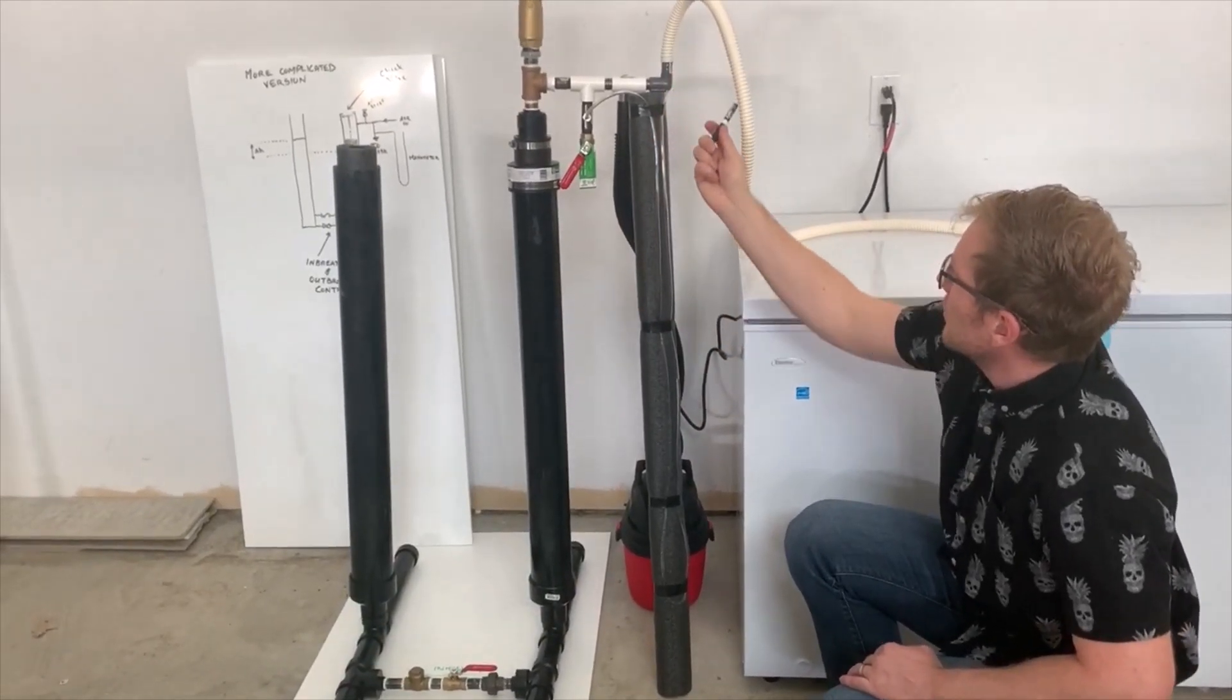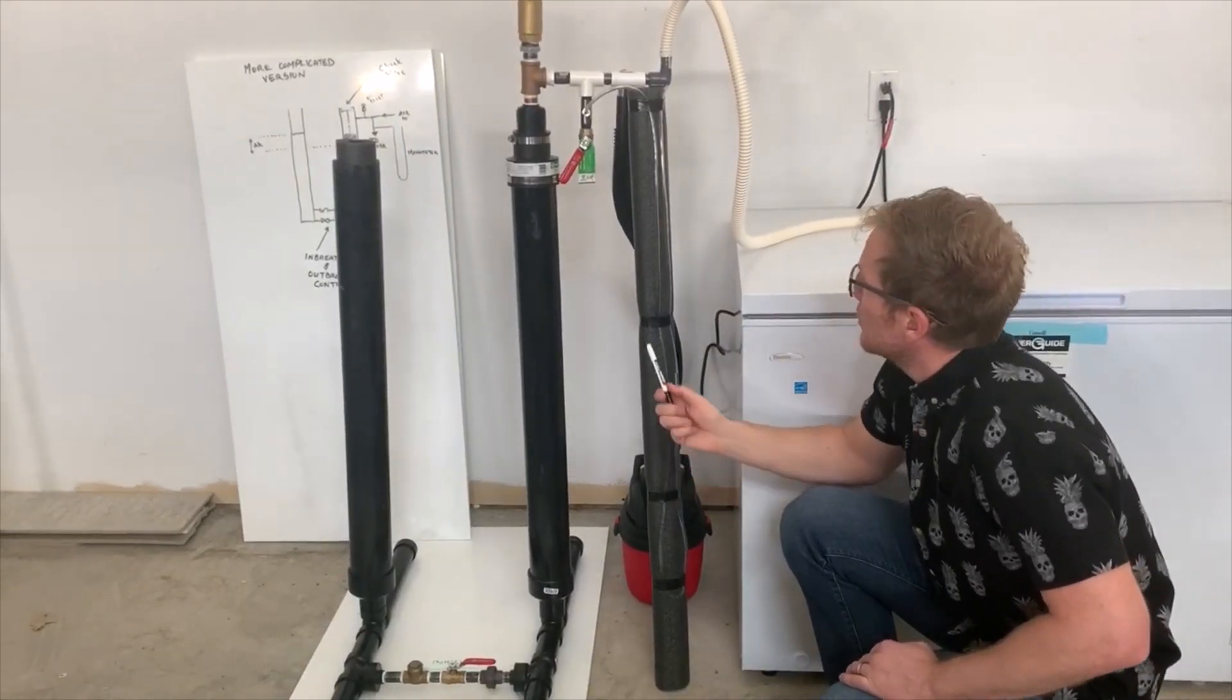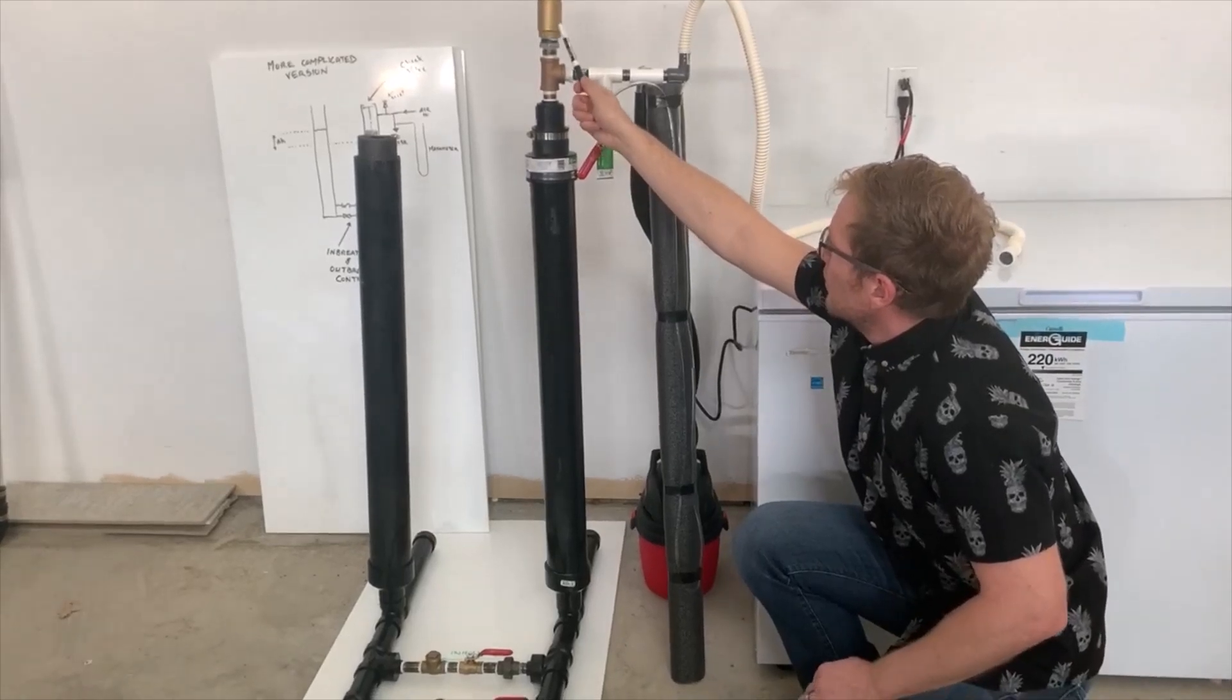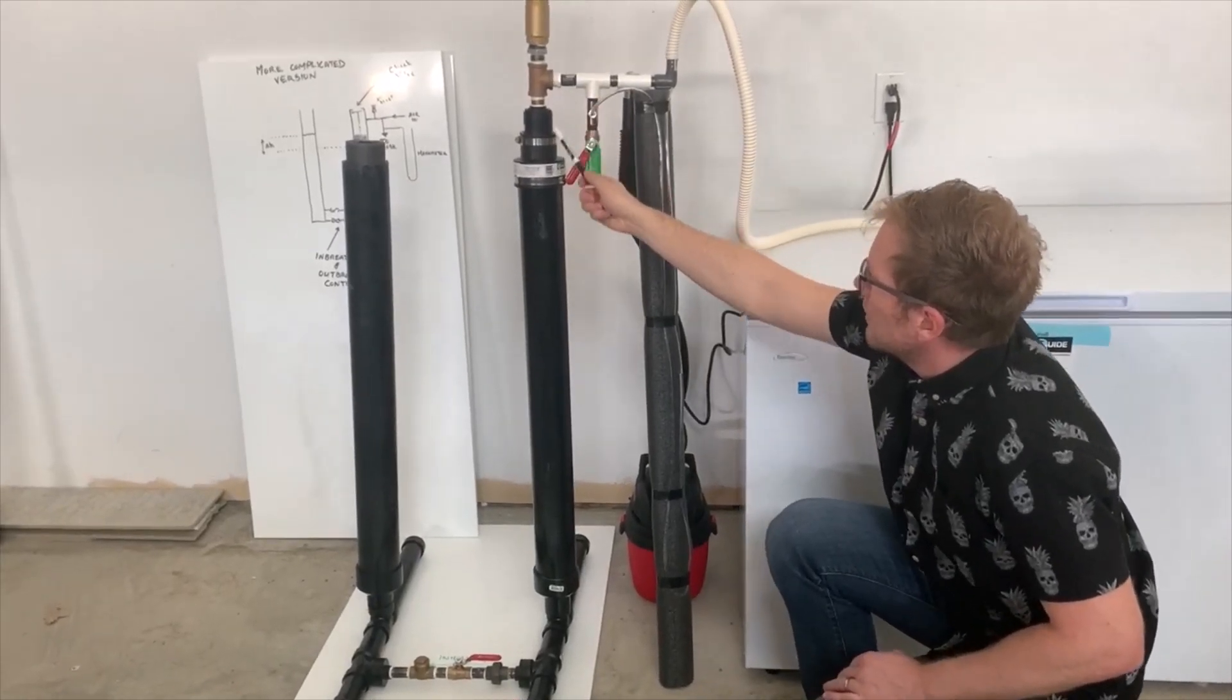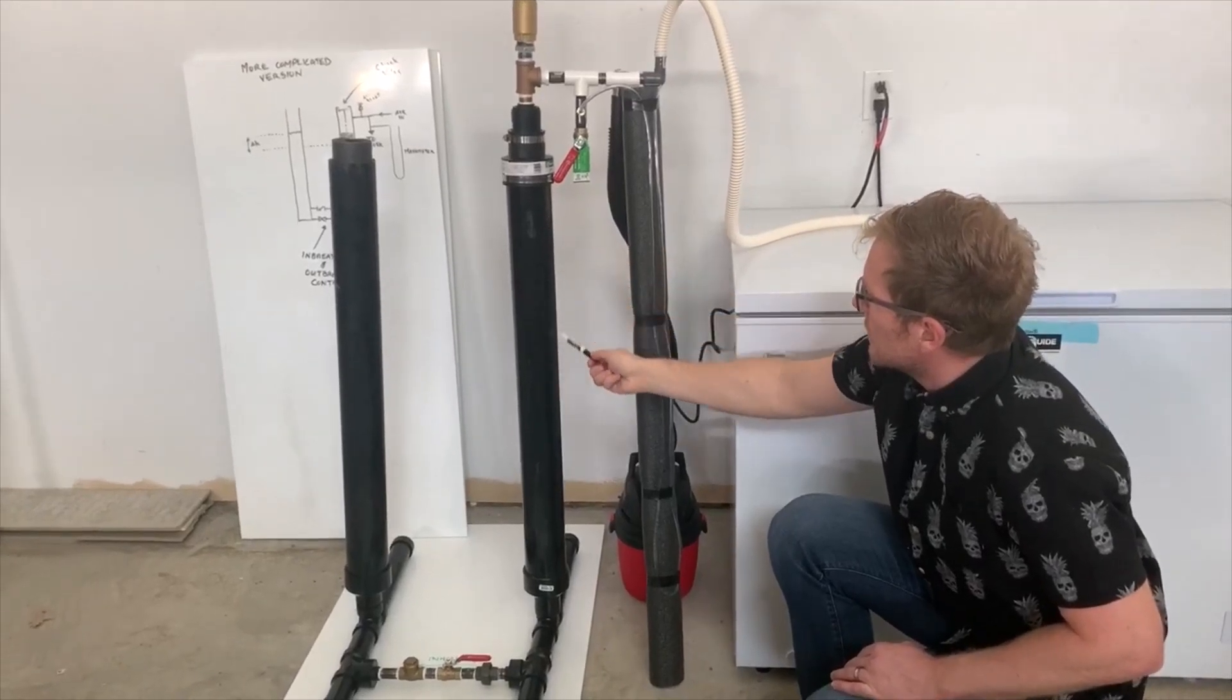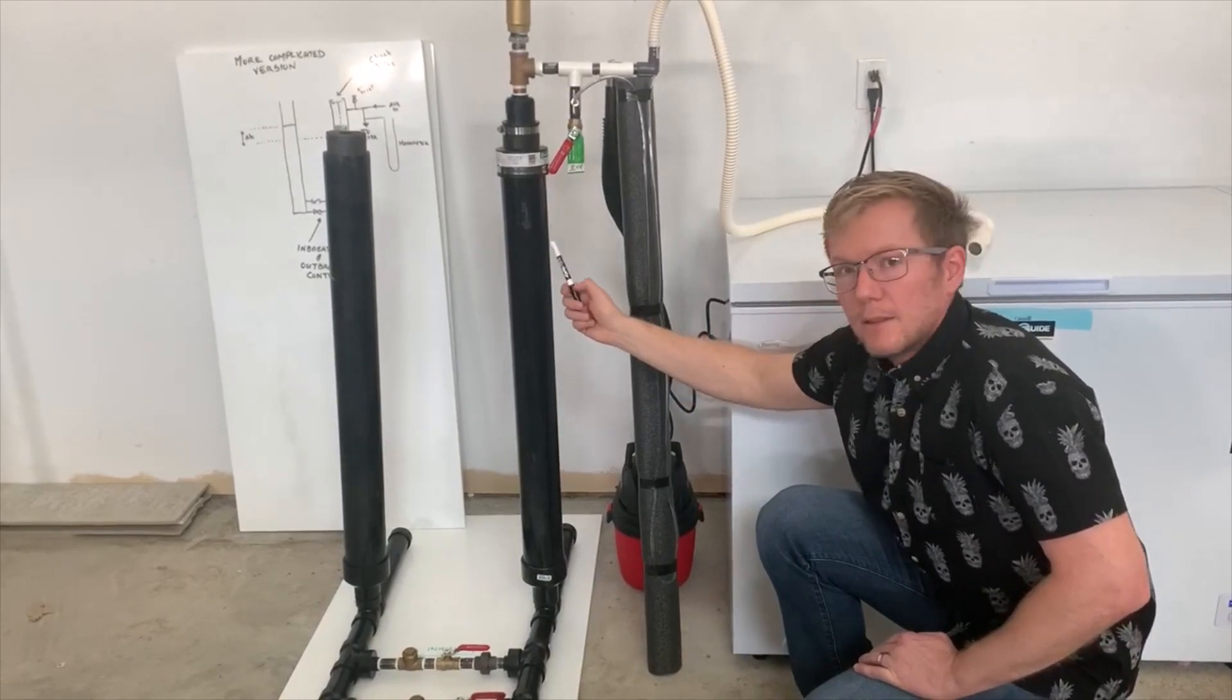This line here would be the one that potentially goes to a mask or intubation tube. This is a check valve which has a chain and a push rod going down into this side of the tube. Inside this side of the tube is a float made out of two-inch ABS plastic fittings.